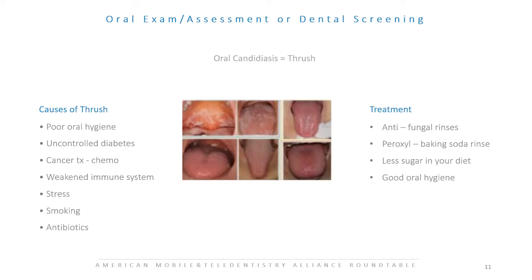So it'll be better for patient education. It'll be better for the facility and the medical dental integration, as well as my dentist when he is doing diagnosis for our next step forward for referral or prescription, or whatever direction we're going in. So I am just so happy with Teledentix. I know that we've come a long way in a year, and I'm excited to see where we go in 2022, but definitely TelScope is something that I look forward to implementing with all of my seniors.